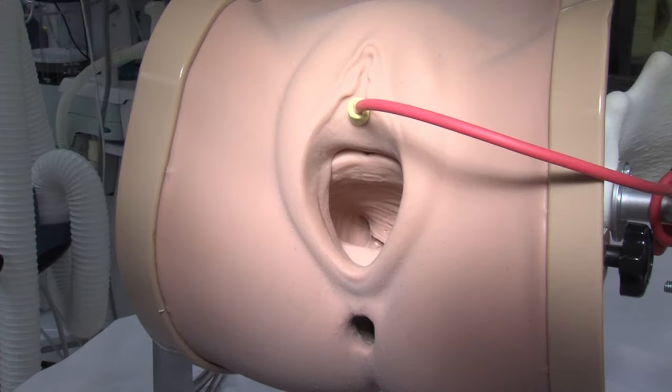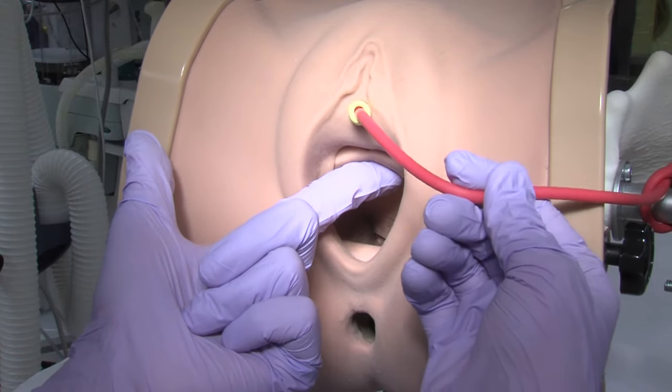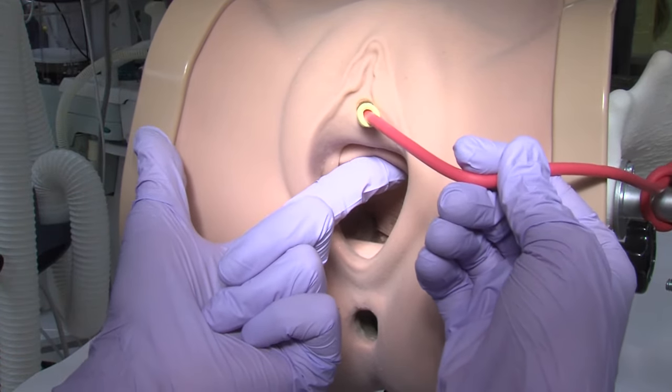With the patient in dorsal lithotomy, place a Foley catheter for recognition of the urethro-vesicle junction.